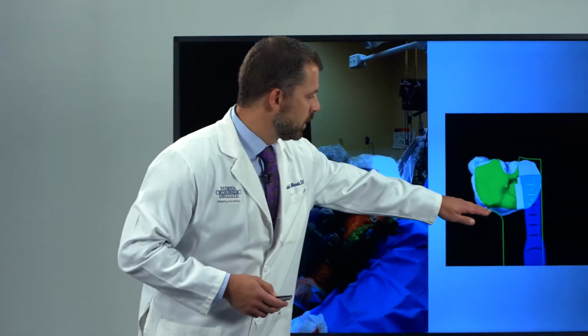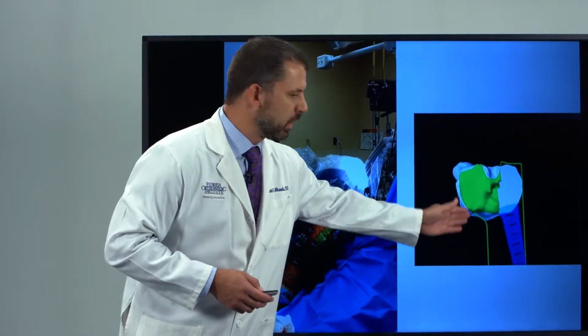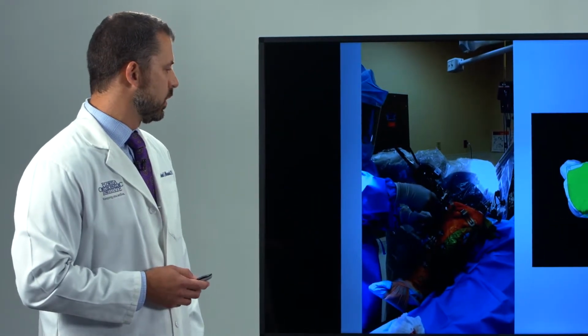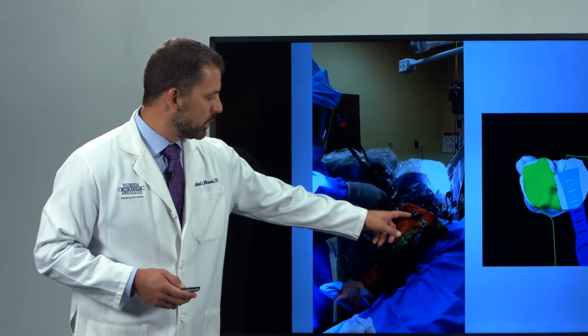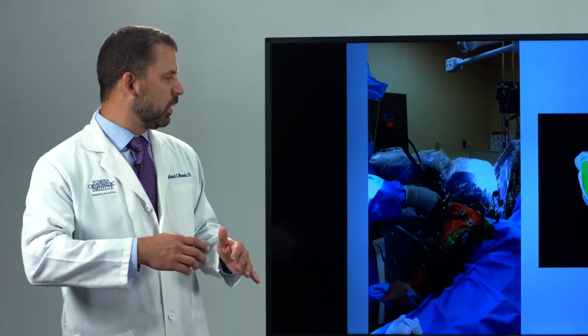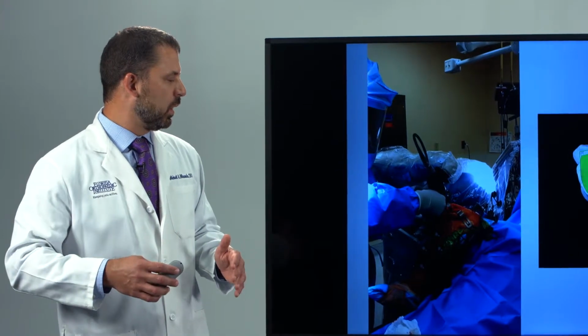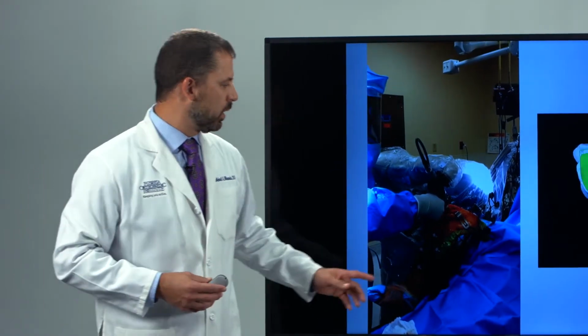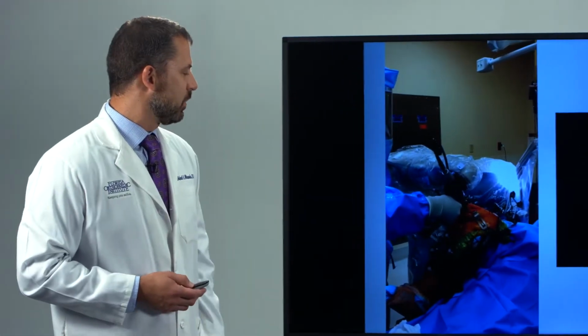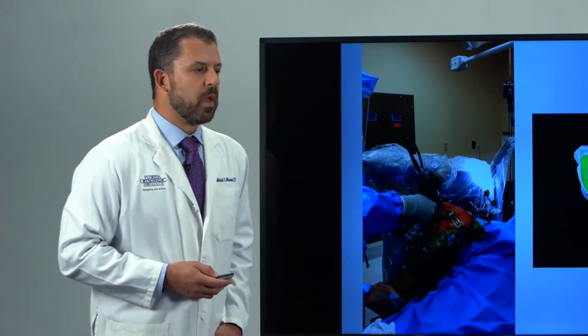So over here is the kneecap and the patella tendon, so you can't get into cutting into that area. It prevents you. You still certainly need to use soft tissue retractors to prevent any kind of bumping or tearing of vital structures in the knee, but I think it's a safer method of doing this.